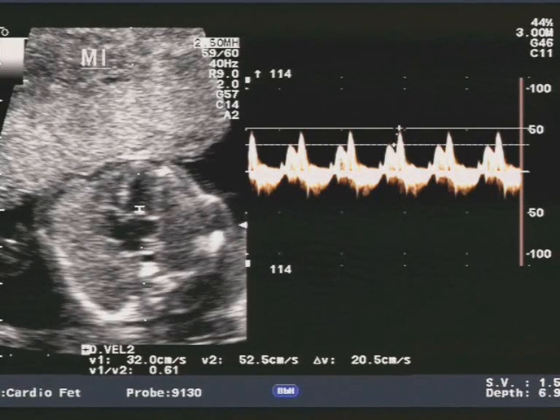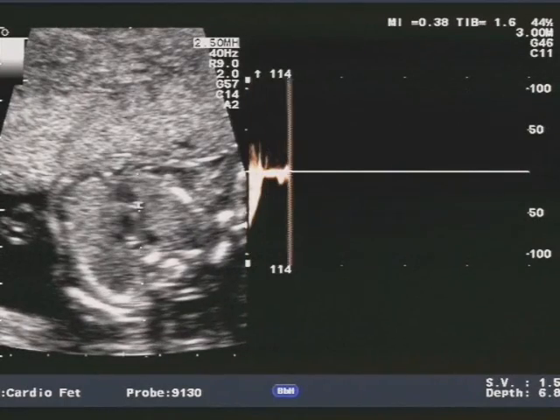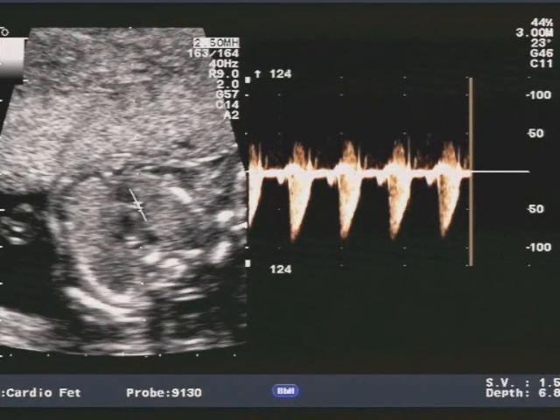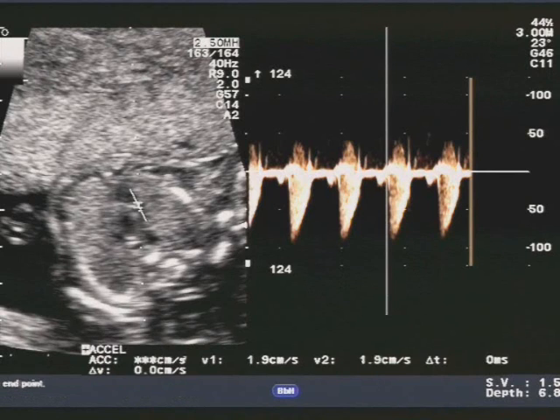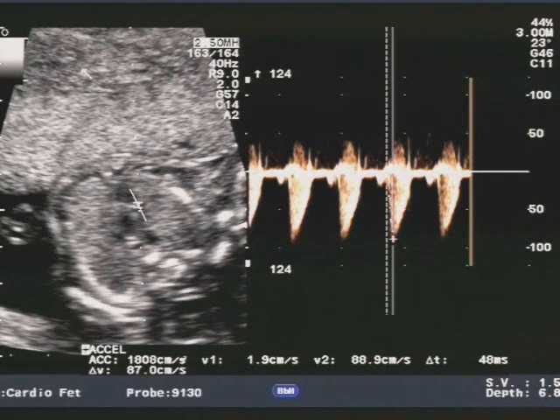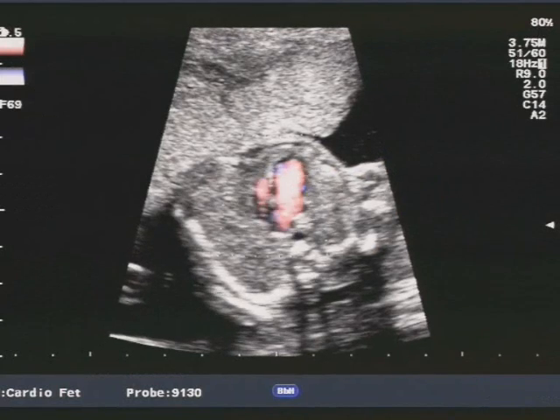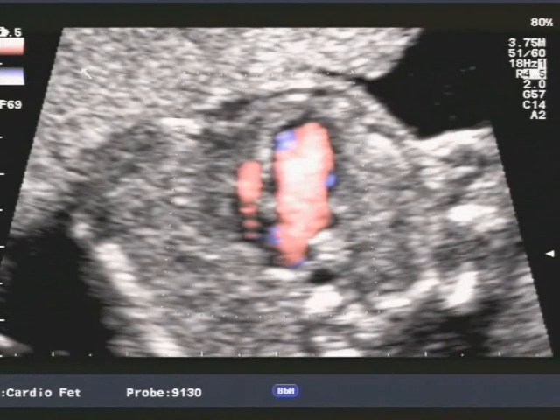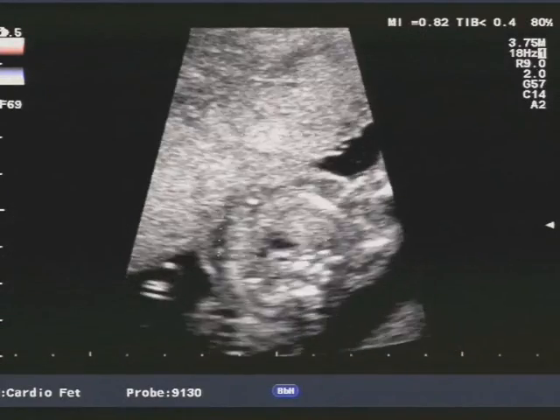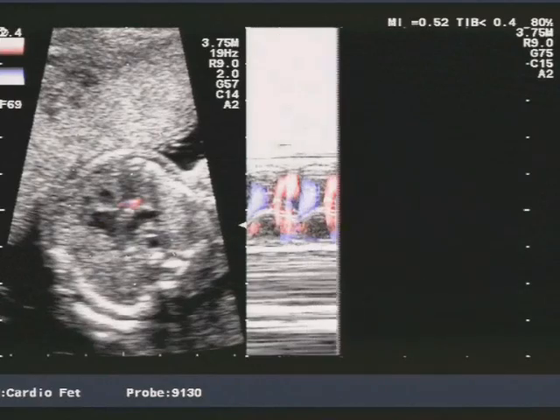Avete visto la differenza di dimensioni con un ventricolo destro più piccolo, ma con nostra grande sorpresa, avete visto lì il doppio del pulsato: vi è un flusso trans-tricuspidale assolutamente regolare. Si tratta di una forma non severa, perché il ventricolo destro è più piccolo ma è ben formato. La tricuspide funziona bene e anche la valvola dell'arteria polmonare funziona bene.